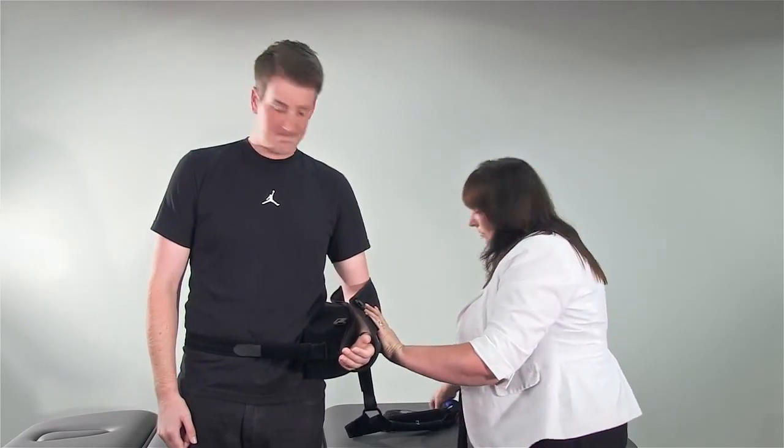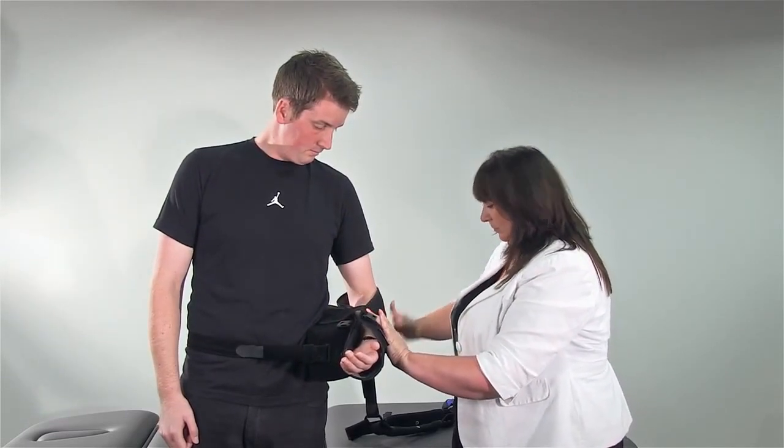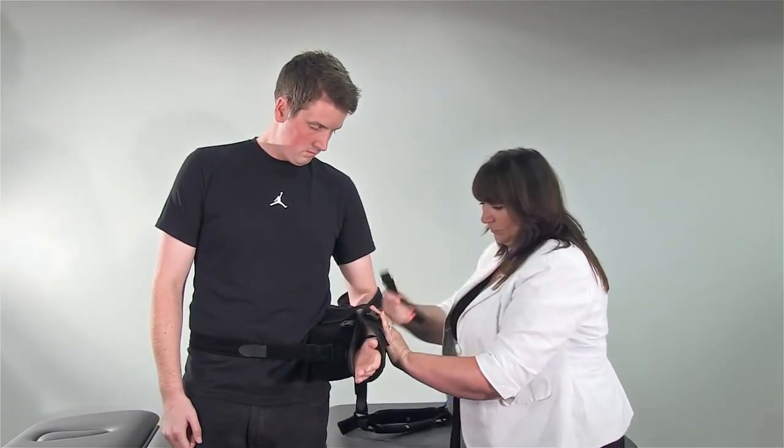Attach the forearm strap to the sling and cushion. Then secure the thumb strap between the thumb and forefinger at the front of the sling.